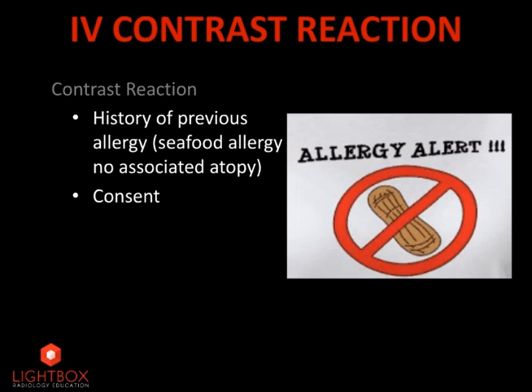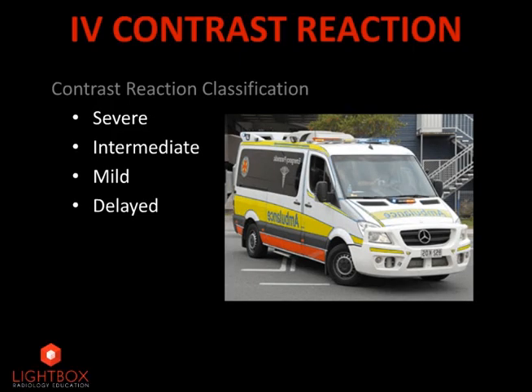A reaction to IV contrast by any patient should be documented to ensure it is not administered in the future. In most institutions, consent is required before the administration of intravenous contrast. It should be noted the previous belief of cross-reactivity between seafood allergies and contrast allergies has been disproven. IV contrast allergies can be classified as severe, intermediate, mild, or delayed.